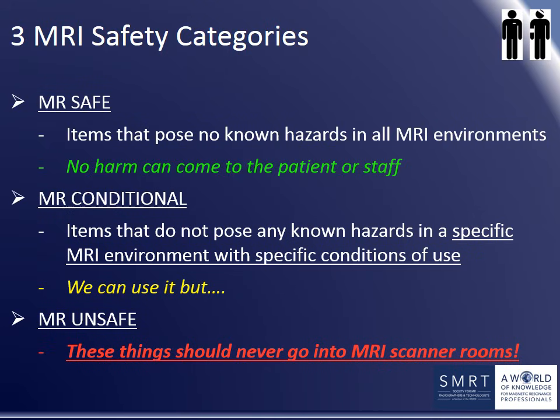For example, MR conditions for an implant, device, or object might stipulate a maximum static magnetic field strength and/or maximum spatial gradient of the fringe field. MR unsafe items should never be taken into the MRI scanner room. They are not safe in any MRI environment.